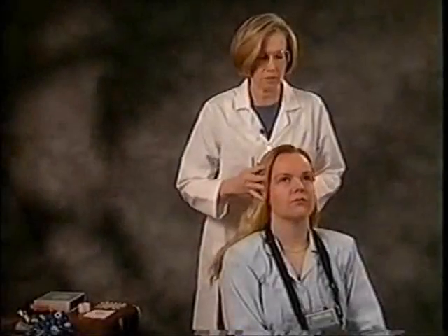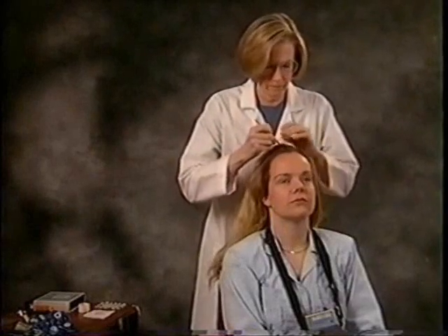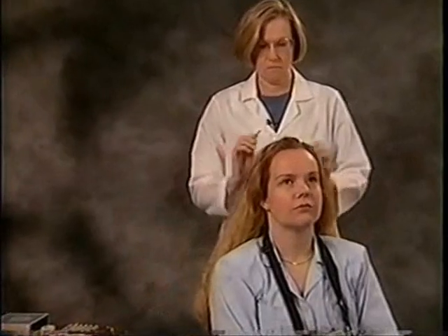I'd like to spend some time showing you the different techniques for applying the Enet on different hair types. For very long hair, part the hair along the midline. Apply the Enet in the usual manner at the nasion and preauricular points.